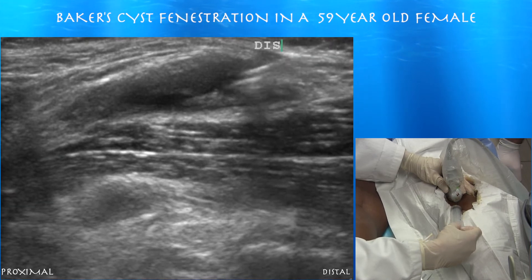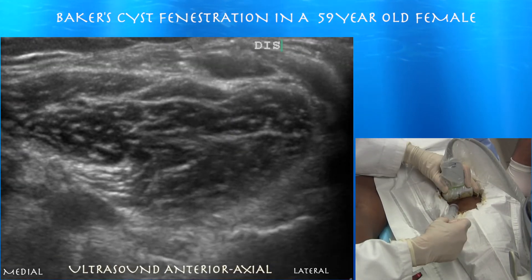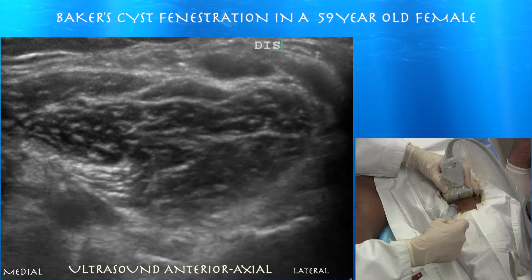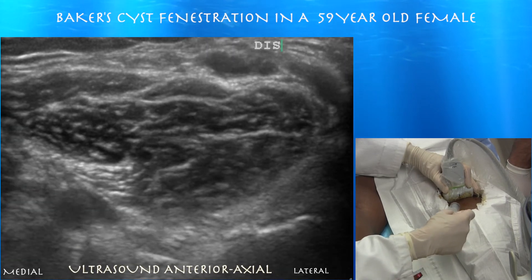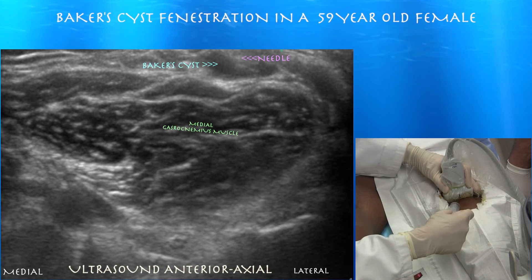Here we are fenestrating the cyst, going in and out of the inferior wall. Here we're in an axial view where you can see the needle tip — this is useful to get your medial-lateral orientation. When fenestrating the cyst, we're trying to cover not just one part of it but a pretty good area of the wall.